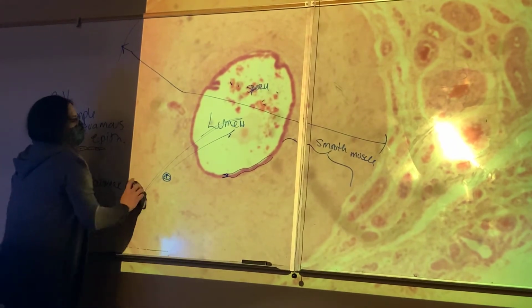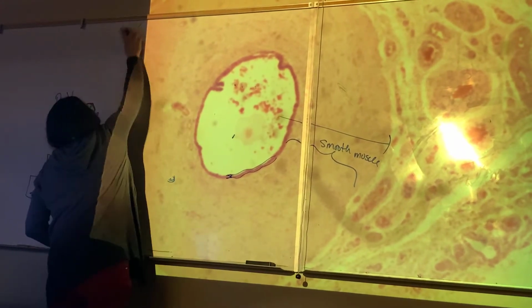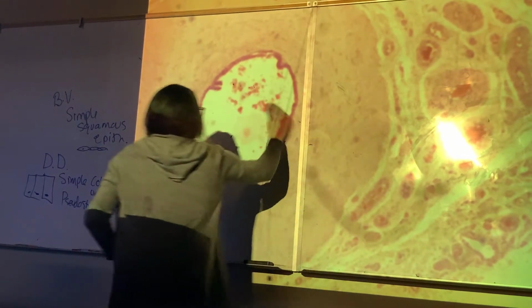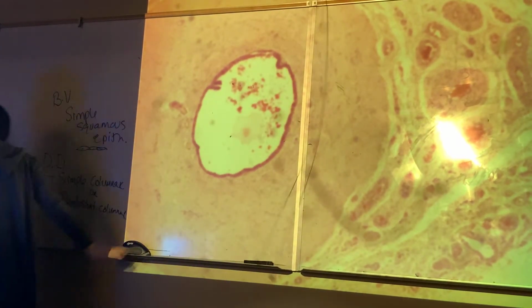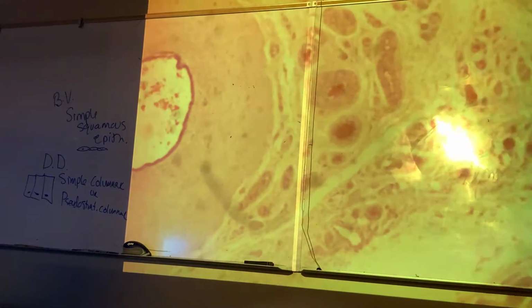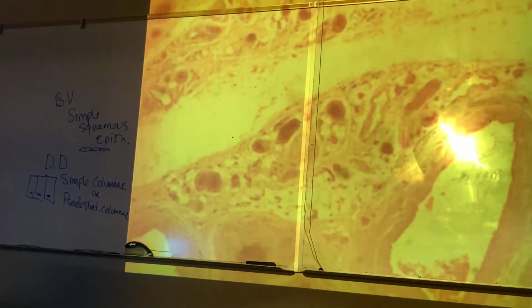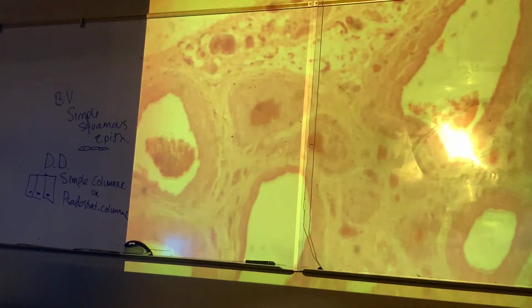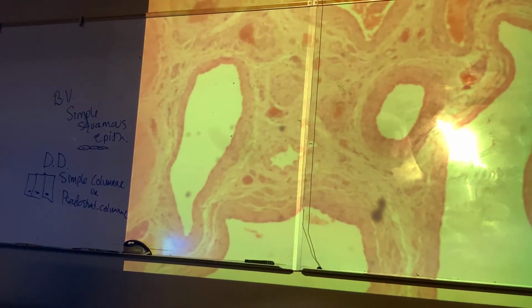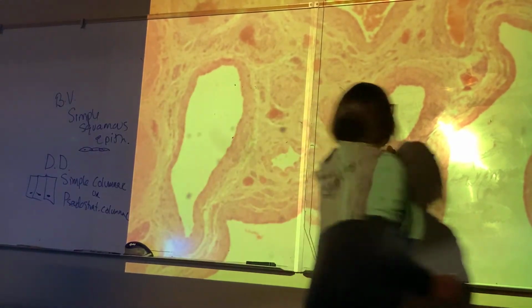Now, let's look at an artery so you can compare the two, and we'll look at a vein also. Okay, so again, there's only one of those in there. Come over here. Yeah, this is a good section here. This is an artery.